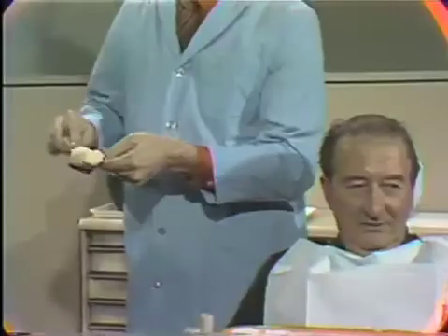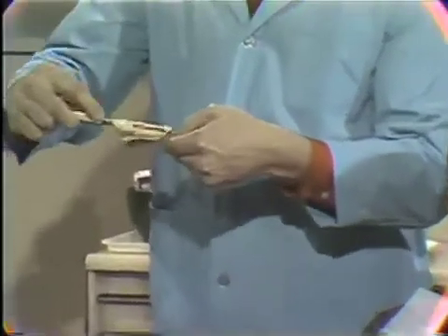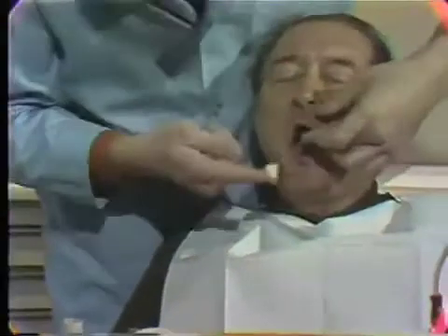After mixing the material until smooth, the tray is loaded. Notice that very little of the mix is placed in the tray. A small amount of material is first wiped into the labial vestibule to avoid trapping of air.